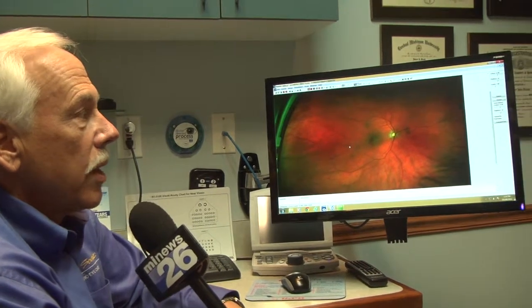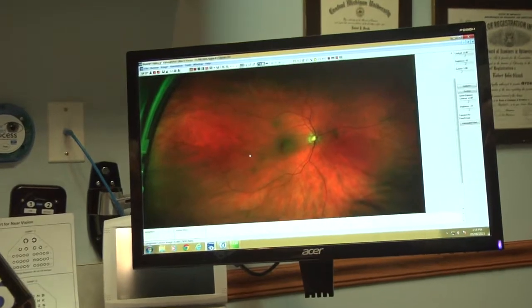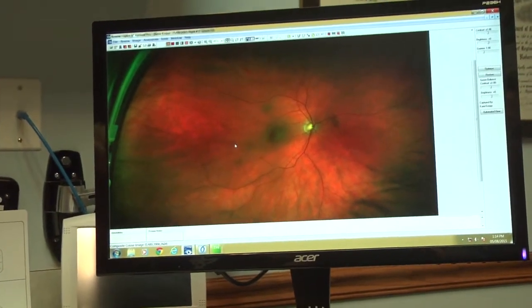And then if there's something that is of importance, we can go with other lenses and look at it with other technologies as well. Now, is there a wide range of differences when you take these pictures of someone's eyes? Or for the most part, they're pretty similar? Well, yes, they're pretty similar. Everybody has the same parts and looks pretty much the same. There are some small differences and subtleties between each eye that makes it unique, but things look pretty much the same. So when we have an image like this and we look at it, we look to see that things are normal. And we can do that by a variety of things that we can manipulate with the screen, and we can look at different parts of the eye with different magnifications.